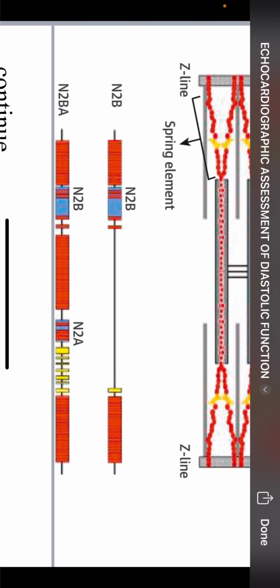And we can measure its time. The normal range, depending on where you're reading from, is around 70 to 90. If it's beyond 90, the springing part is happening so slowly, and we don't want that. So a time of more than 70 or more than 90, depending on the condition, for isovolumic relaxation time is not required. It's abnormal. It's an indicator of diastolic dysfunction.